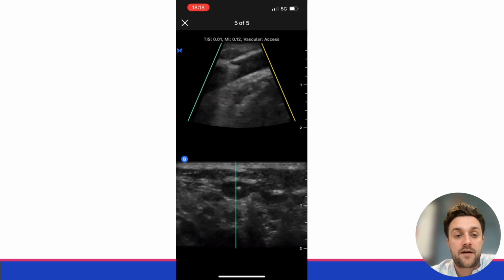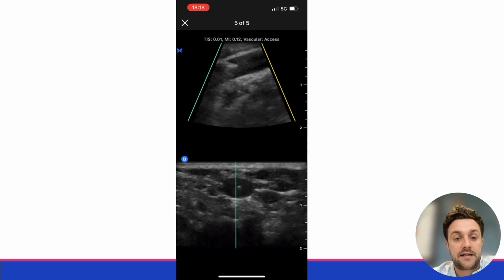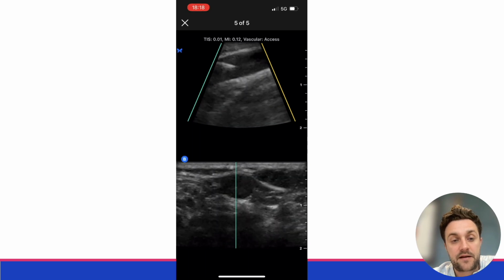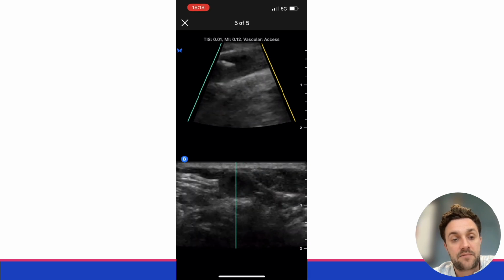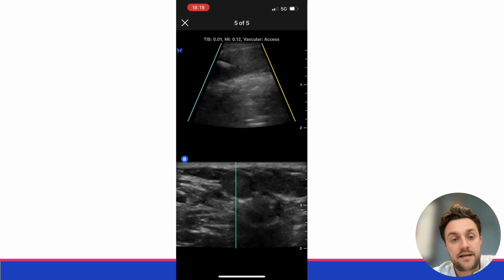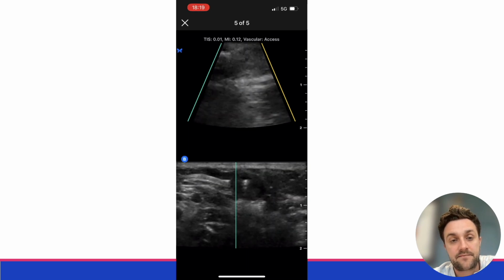Okay, and if you keep your eye on it, you'll see eventually that there's quite a lot of the cannula in the vein. So you'll see here that this needle keeps disappearing in and out of view. Okay, and that's just doing our probe needle, and up here it is marching up the vein. So you'll see in a second it'll pan back, and actually quite a lot of this cannula is in the vein, and that will really increase our chances of it staying in.